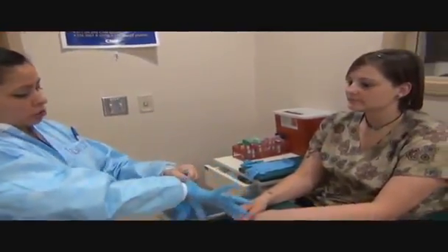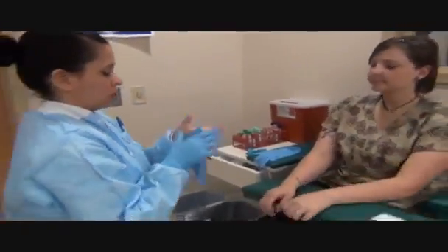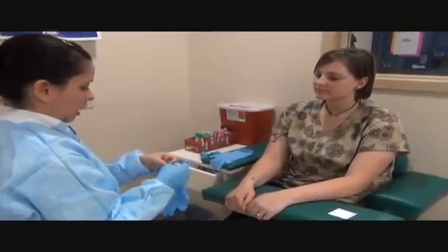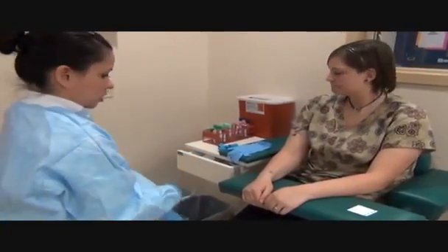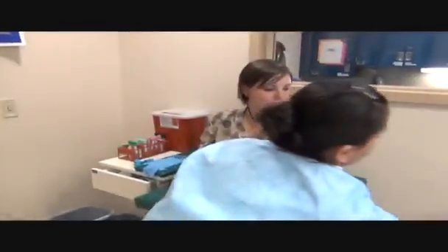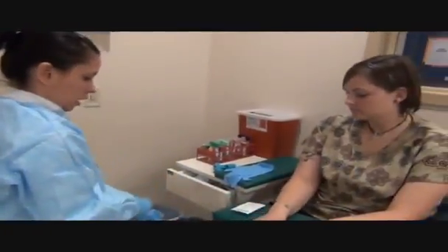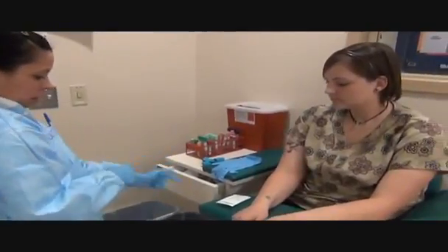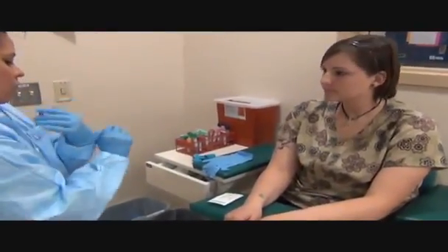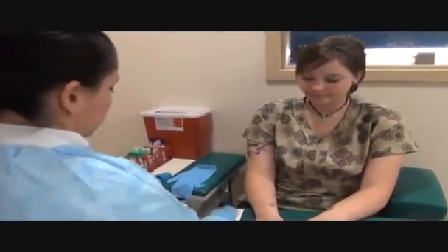Which hand do you prefer? Doesn't matter to me. Okay. I'm going to be doing a butterfly hand draw. I'm going to be using a BD Vacutainer butterfly that you activate outside of the hand or the patient's arm.